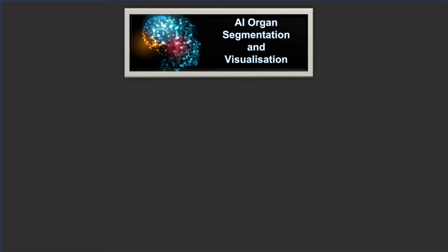Hi, my name is Barbara Villarini, and I'm going to present the AI organ segmentation app that I developed during my Royal Academy of Engineering Leverhulme Trust Research Fellowship.